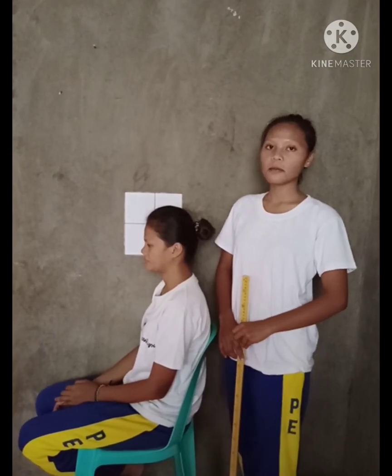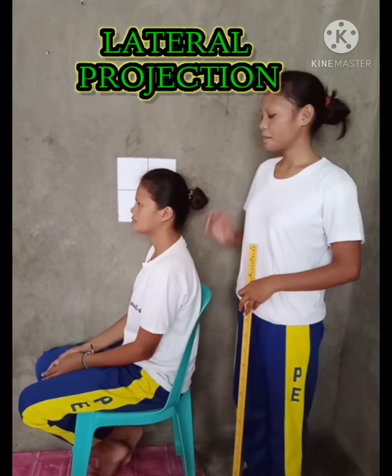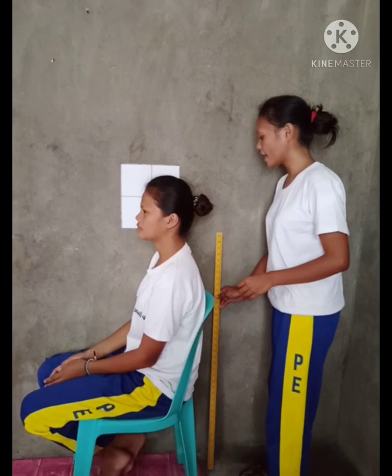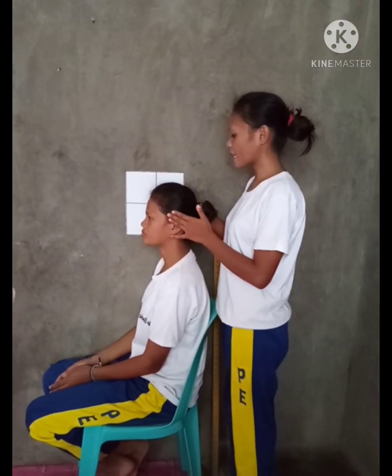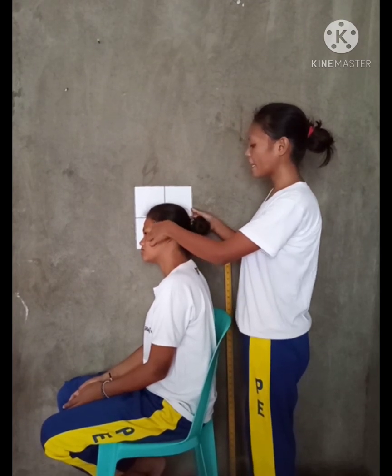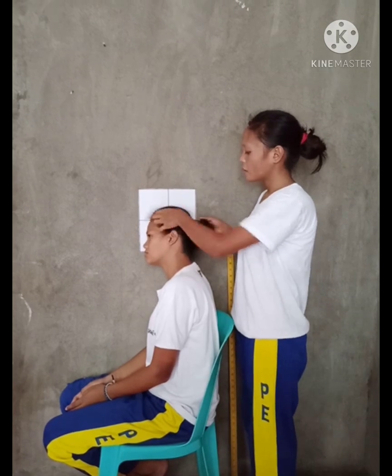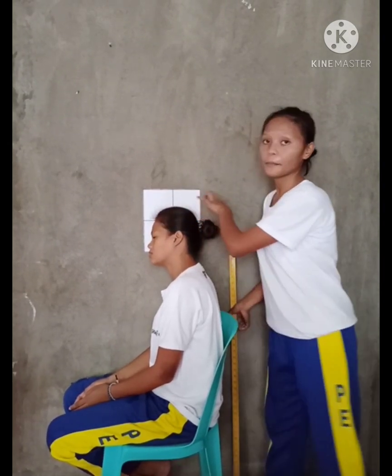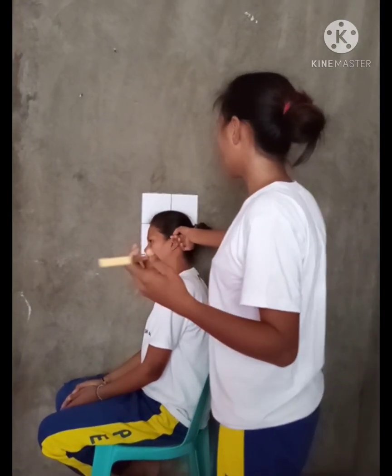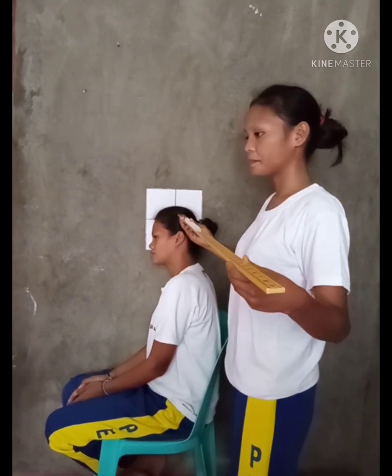Good day, ma'am. Let me demonstrate the projections of the skull, starting with the lateral of the patient. The patient is seated upright, and the cassette should be parallel to the head of the patient. The EAM is measured 2 inches above the tabletop. The central ray must be perpendicularly directed 2 inches above the EAM. So, here is where the central ray enters.